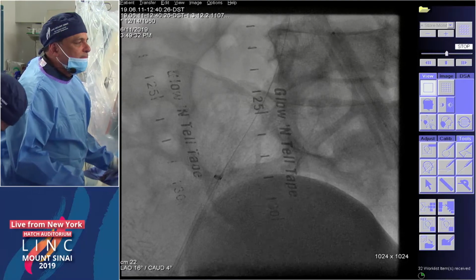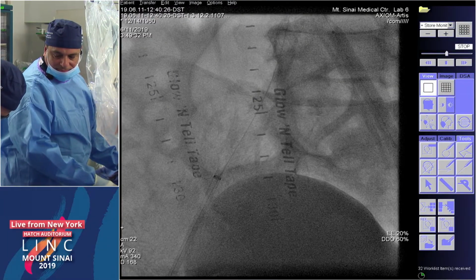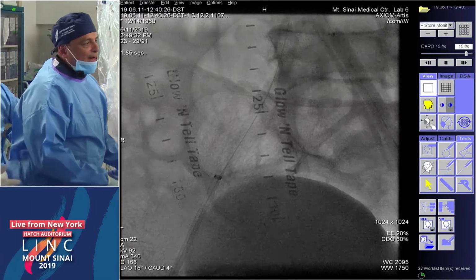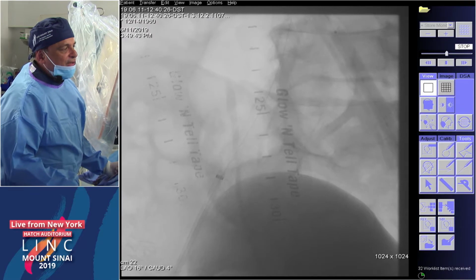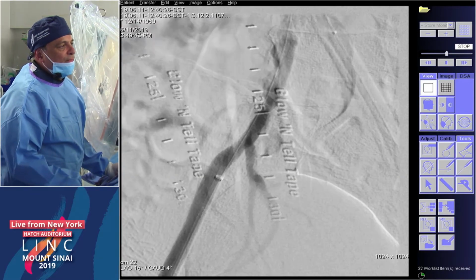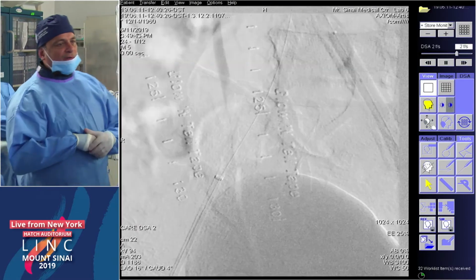The size of the urinary bladder gives away that you were not working for quite some time. Actually, we had done an IVUS, and we actually weren't working that long on VAR because I was in the other case in room 4. So I think Vishal was just taking diagnostics. We took a lot of runoffs down.